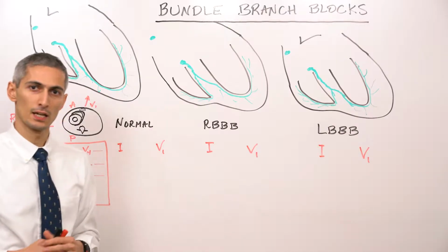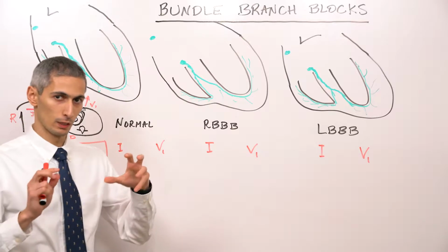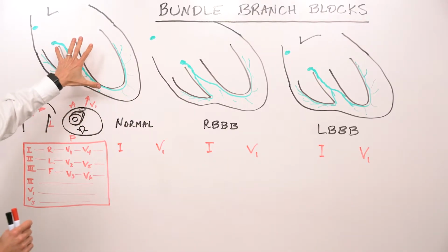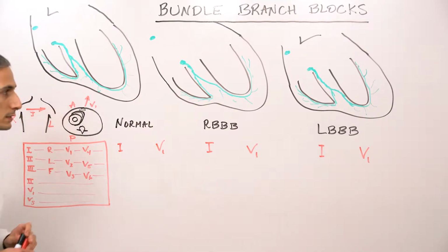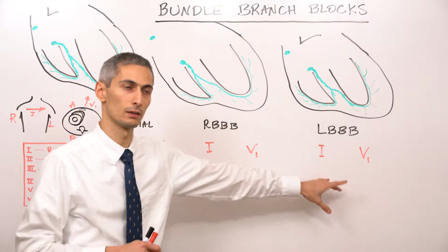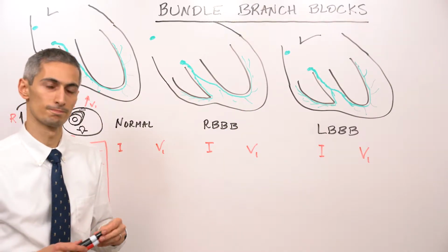Okay, I'm Zaven Sargsyan, and I'm going to explain bundle branch blocks. So the main components of the talk are going to be to very quickly review how we get a normal depolarization, talk about where on the EKG to look for bundle branch blocks, and then finally to explain how the abnormalities electrically arise based on understanding of how the depolarization happens.